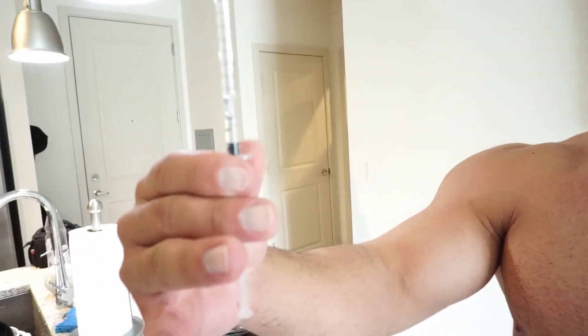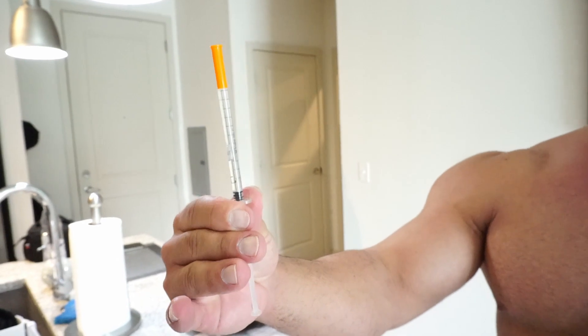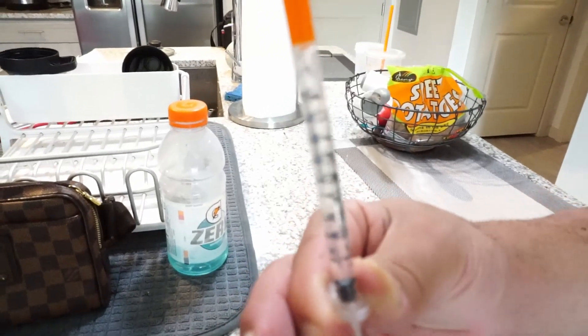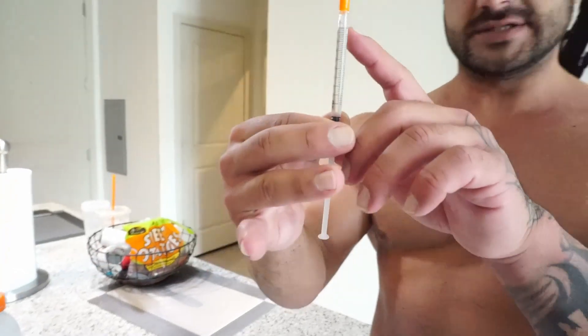Now we're gonna turn it upside down — you see the bubble now? Let the air bubble go all the way through, give it a second. Hold it straight up — notice how this is not moving at all. Now you see the air bubble here.